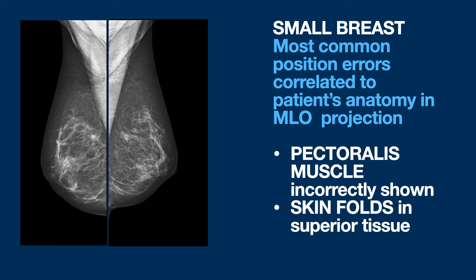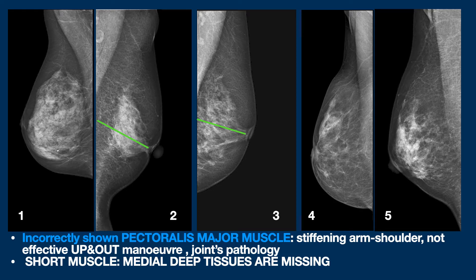On the deep tissues, one often notices in women with small breasts and a very slender thorax both an incorrect documentation of the pectoralis muscle and the presence of folds in the upper part. It can be a concave-shaped muscle, as in figure 1 — possibly due to stiffening of the patient at arm-shoulder level, or in this specific case, an up-and-out maneuver that was not properly performed. It can also be, as in figures 2 and 3, a muscle that is too short.